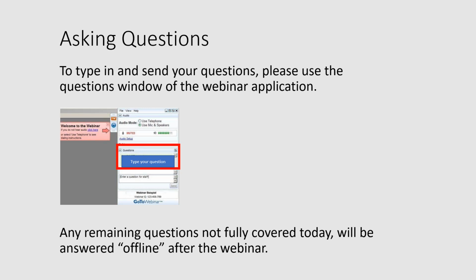Yes, Navilas is the only laser machine we use for retinal lasers in our unit, and precise peripheral treatment with Navilas is definitely possible. The only times we have not been able to use Navilas are for patients in whom the peripheral retina was difficult to view even on the slit lamp.